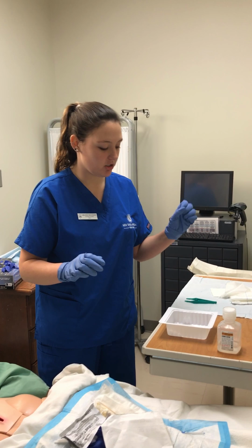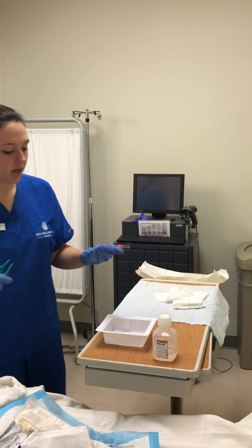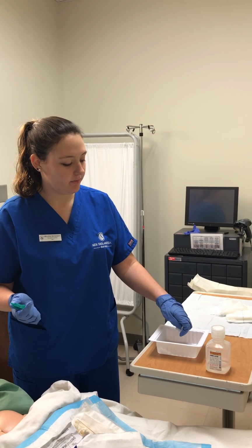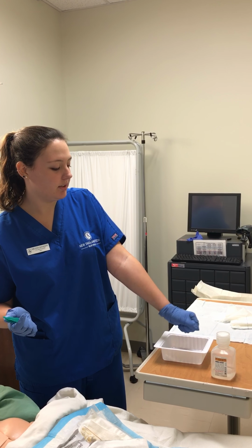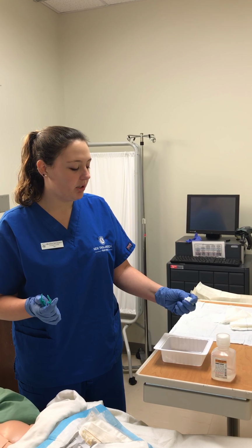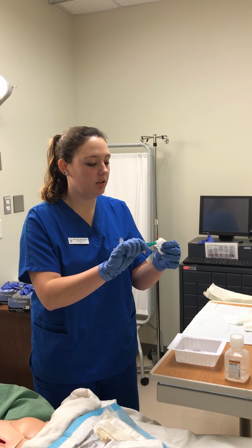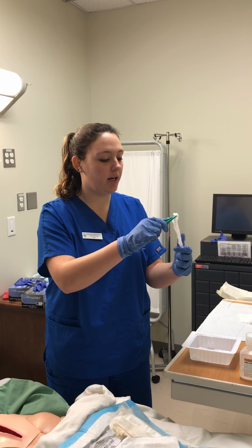This hand is about to become clean. I'm going to grab my forceps before beginning. Now once this gets wet, it is clean, so keeping that in mind while packing. I'm going to drain out the excess saline. And I'm just going to kind of play with it to try and get it fluffed out again. You can use your forceps here.